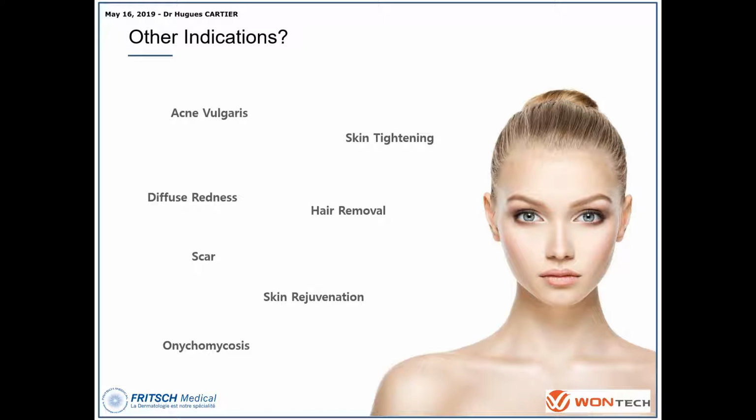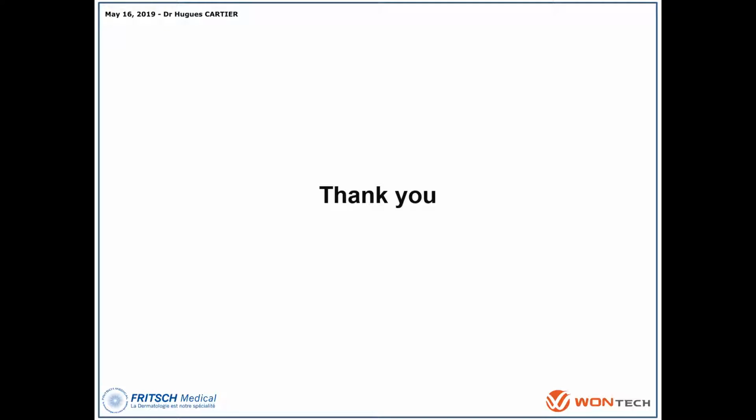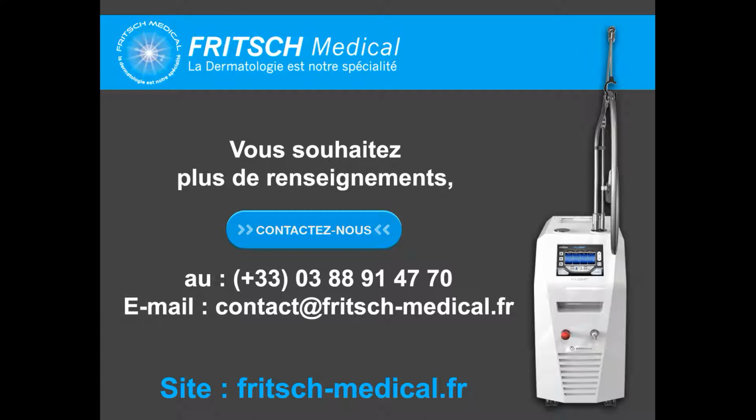Even though I don't use this device for that, you can sometimes use it if you are in trouble with another device. This V laser can be used for hair removal on small areas, and for white to dark skin, because it's a 1064, very important. So in a single session, you can treat many patients with a lot of indications. Thanks a lot.